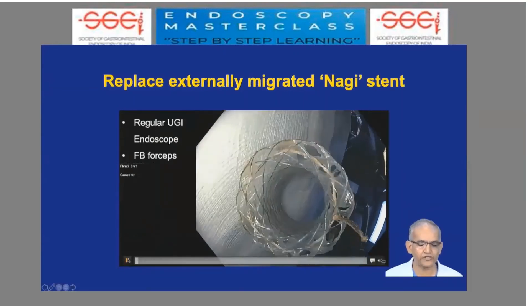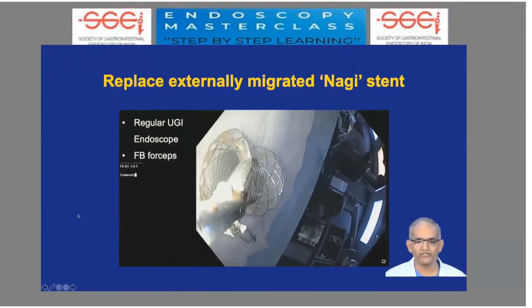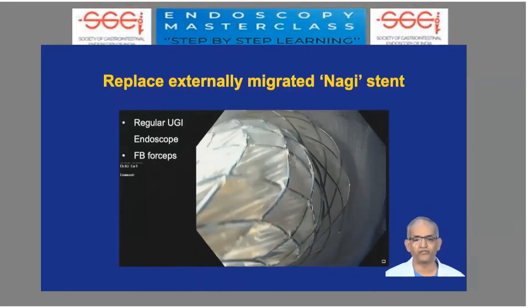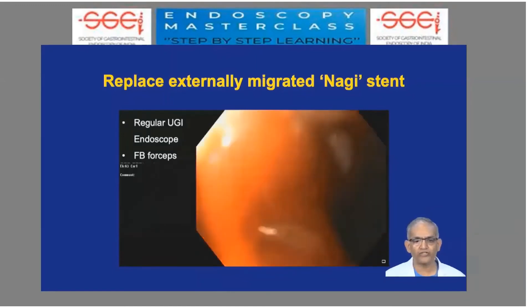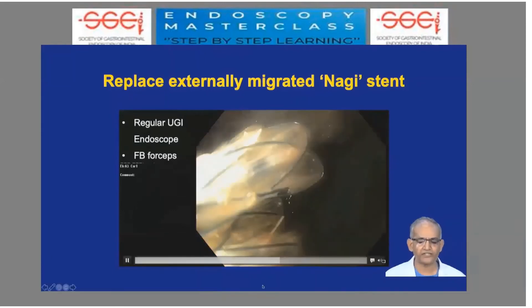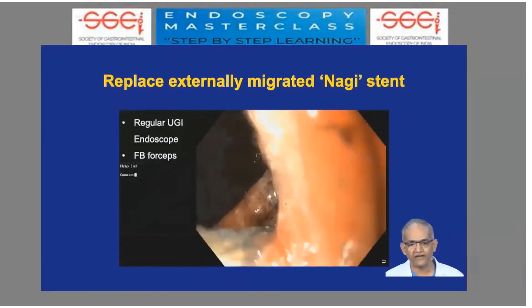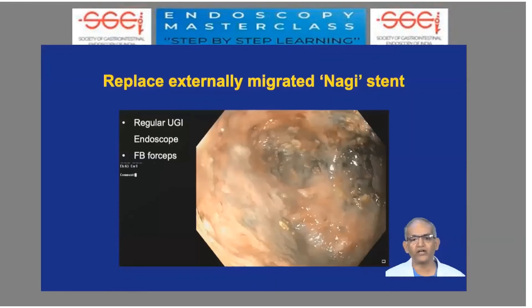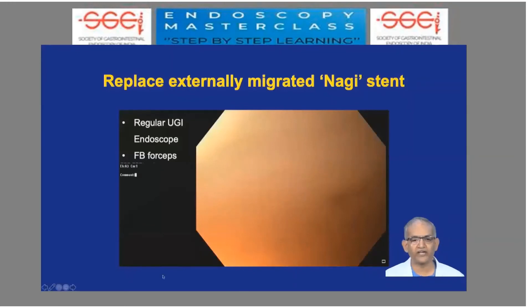An important thing to show is replacement of an externally migrated Nagi stent. This requires only a regular upper GI scope and a foreign body forcep. Through the endoscope, the forceps come out, you squeeze and clean the stent that came out during necrosectomy, pull it back inside the channel of the scope, and take this loaded scope inside. You push out the forceps so the inner flange opens inside the cavity. Pulling back the scope, you reposition and place the stent in the original place and continue the procedure. Healthy granulation tissue with minimal debris is the end point of necrosectomy.